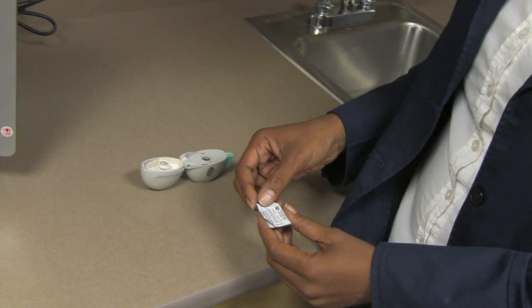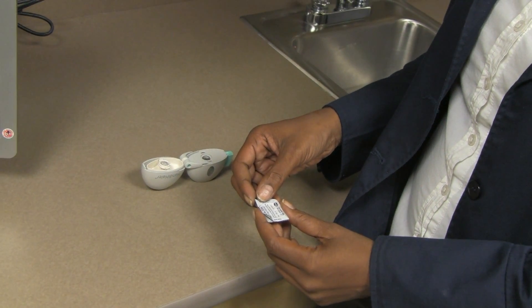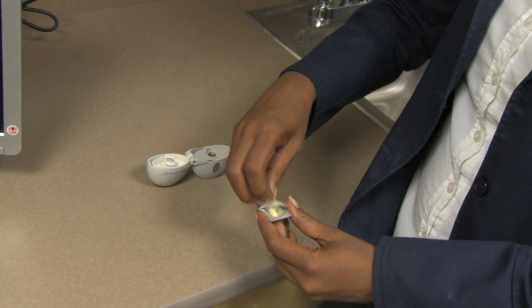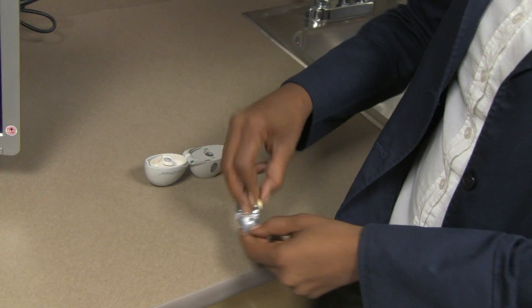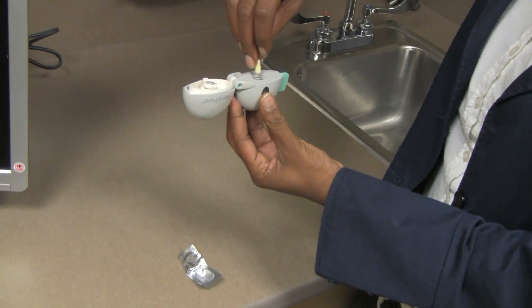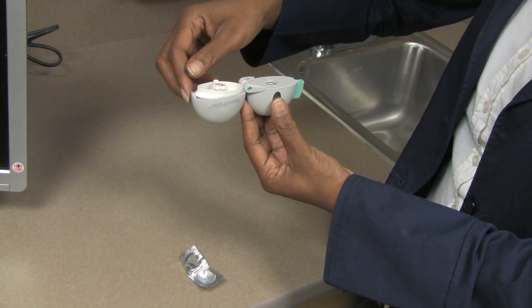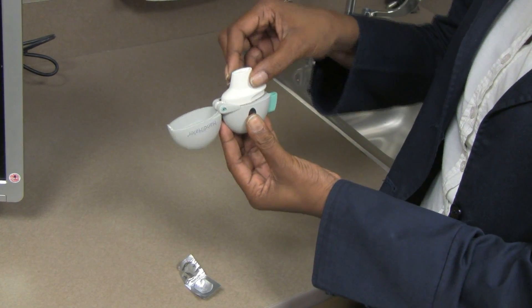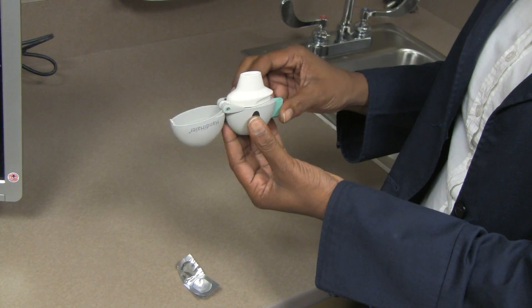Peel back the foil of the blister that contains the capsule by pulling on the tab and remove one capsule immediately before use. Place the capsule in the center chamber of the handihaler device. Close the mouthpiece firmly until you hear a click. Leave the dust cap open.